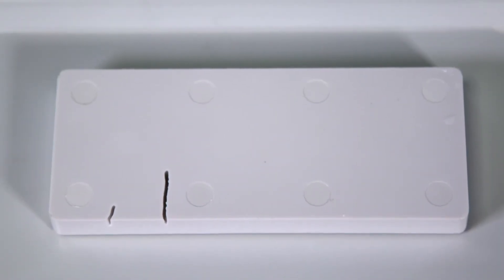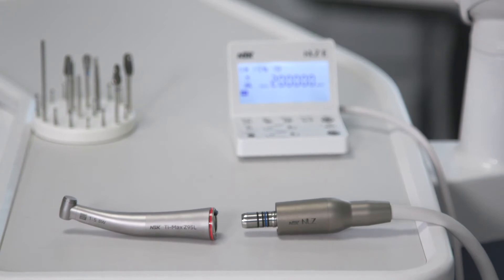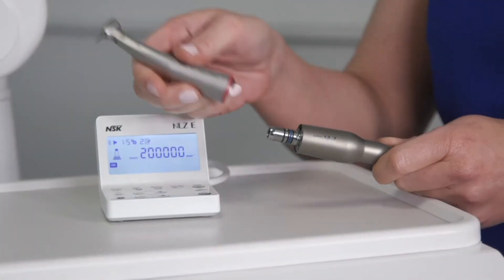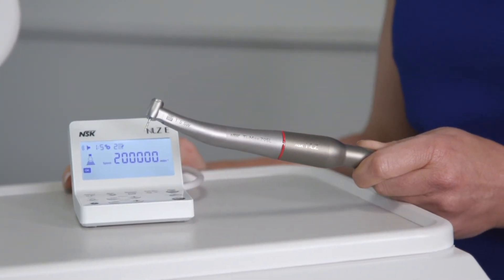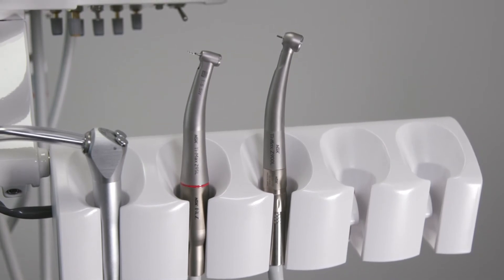Why is a red band preferred over air turbines? Due to the nature of the design, dentists feel red band handpieces have a better tactile sensation, which allows a more connected feel to the material they are working with. The internal components in the handpiece transmit micro vibrations to the fingertips of the user, allowing them to visualise the material they are cutting. The constant drive and torque means there is no lagging or stalling when coming into contact with materials, meaning a smoother and faster procedure.